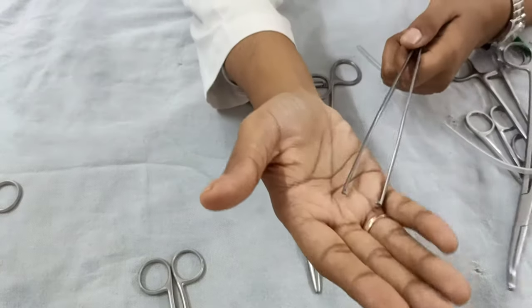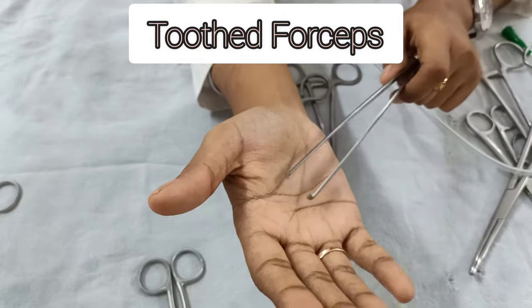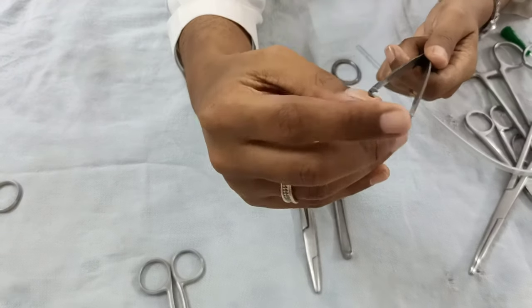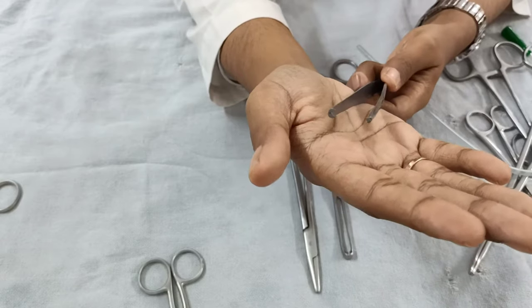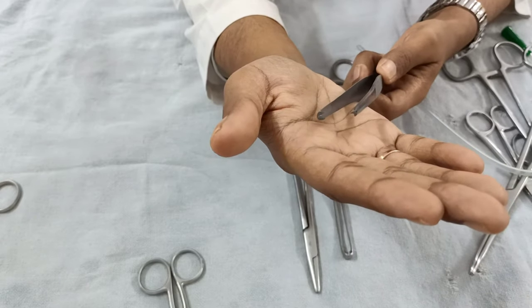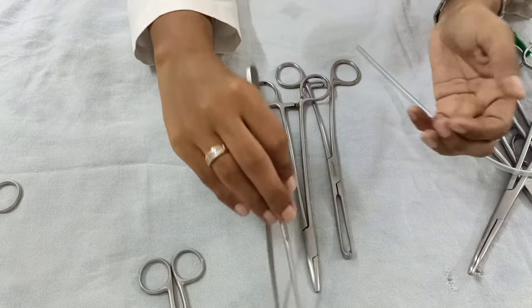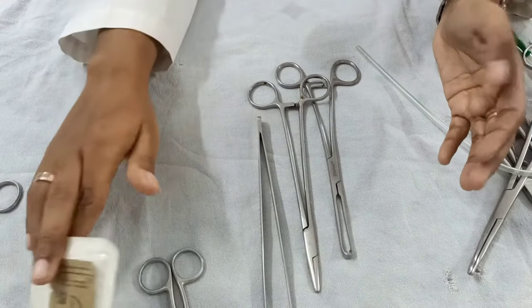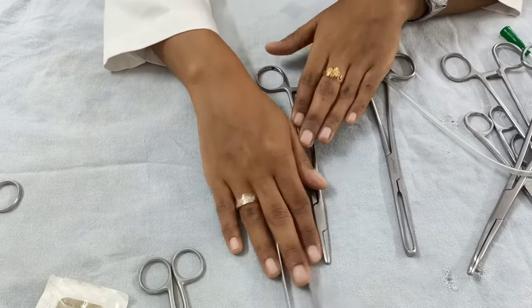Next is the toothed forceps — a toothed tissue holding forceps. It is called toothed because it has a two-into-one tooth arrangement at its distal end, used to hold the skin. For episiotomy repair you basically require a needle holder and a toothed forceps.